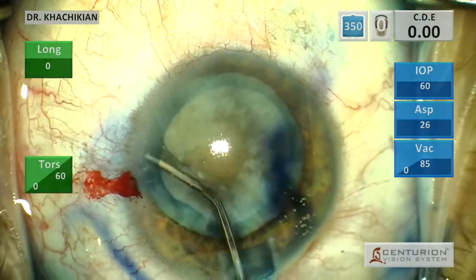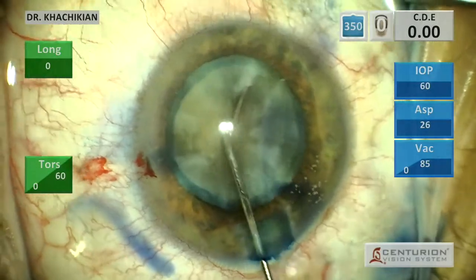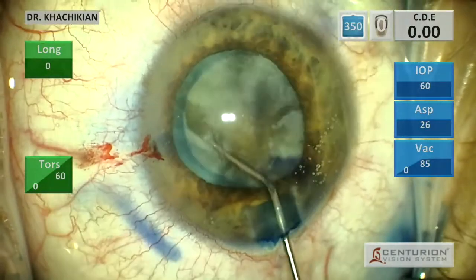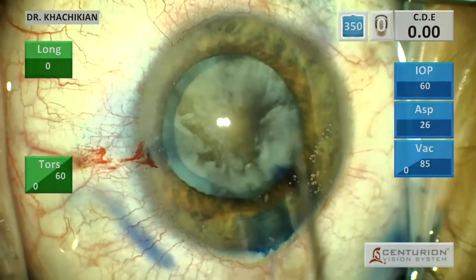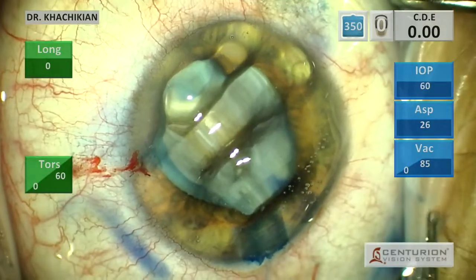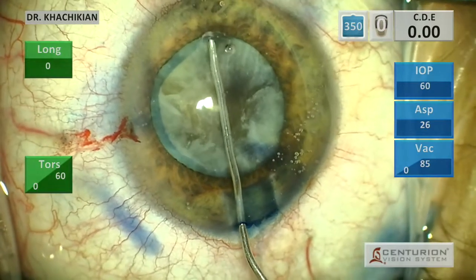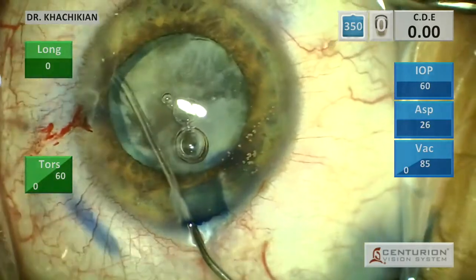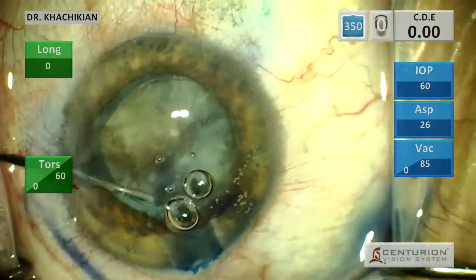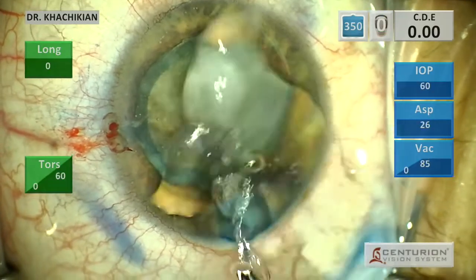We use our BSS to liberate the nucleus and do hydrodissection. Given how fibrotic the lens is, it's unlikely that there is a lot of cortical material that is going to separate from the lens — it's probably all just scarred down and adherent. The lens does rotate very freely. We'll put some viscoelastic on the surface of the cornea, which is good in a longer case so the cornea doesn't dry out. Then we fill the anterior chamber with viscoelastic and try to get some under the anterior capsule and around the nucleus, because we will do a chop technique here. Having adequate space for the chopper to go out under the capsule is important.